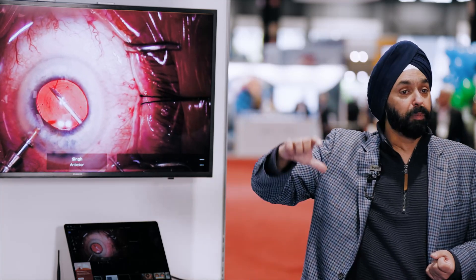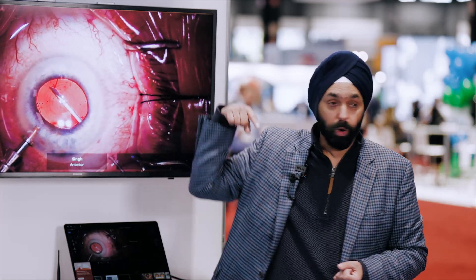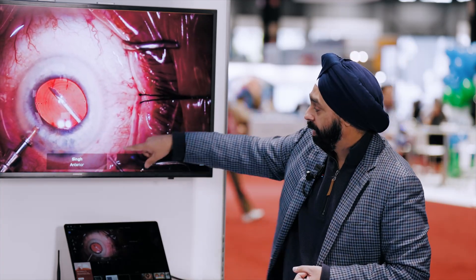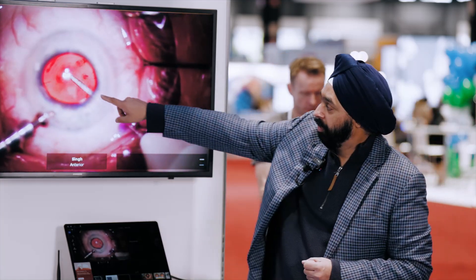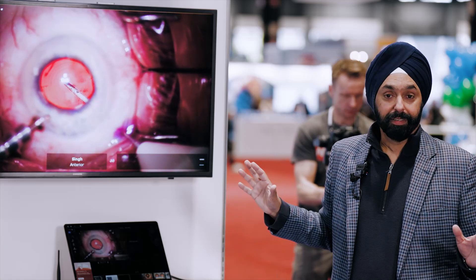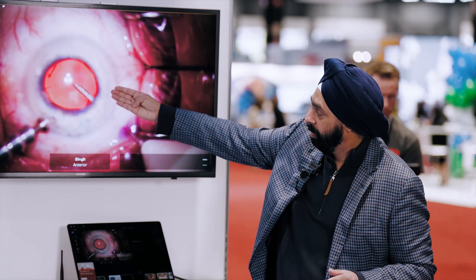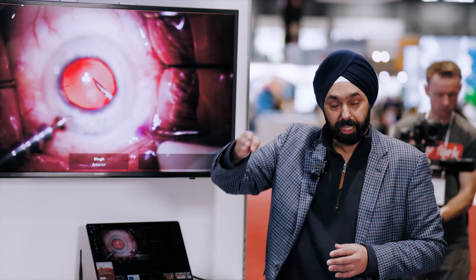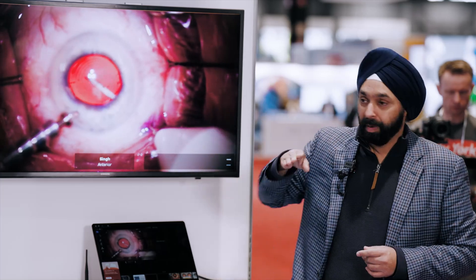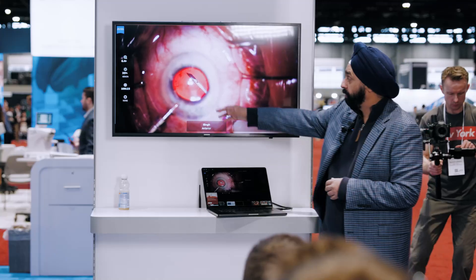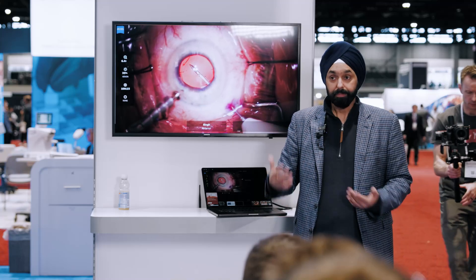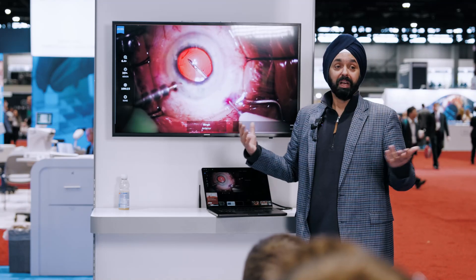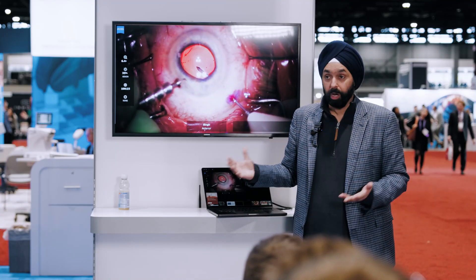It's a 15-millimeter needle, so it can't go all the way to the posterior pole even if you shove it all the way in. You can see all these things coming to the tip — just sit there, maybe turn the vacuum up or down slightly, change the positioning of the tip, but not moving all around. It's a very visually rewarding procedure. The endpoint? When you stop seeing things coming to the tip. It's that basic — that's all we do.